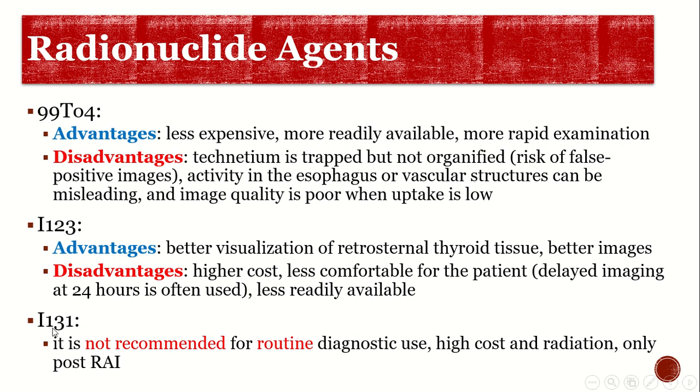Rarely we use the 131 iodine. It's not recommended for routine diagnostic use because of its high cost and high radiation exposure. We use it only to image the thyroid after radioiodine therapy, by 3 to 5 days.